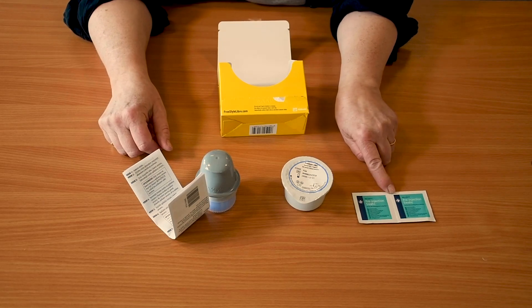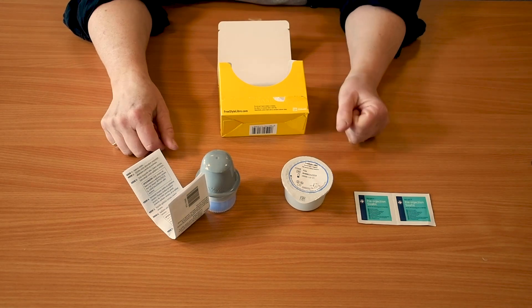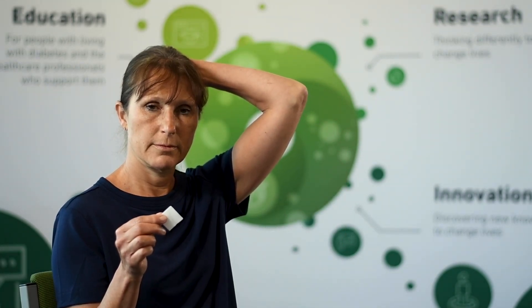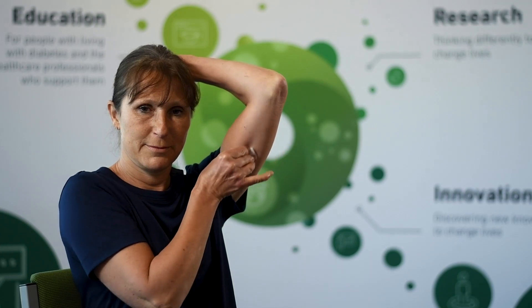Please be aware that you need to make sure the area dries before you apply the sensor. Take your wipe, open it, and clean the area where you are going to apply the sensor. The best way to do this is to put your hand on your head for the arm you are going to be using, then swipe that outer area with the wipe.